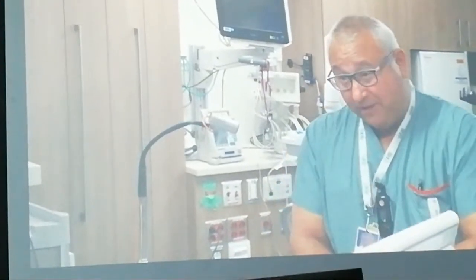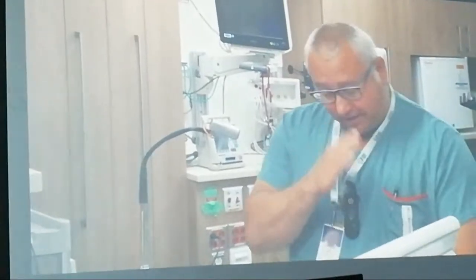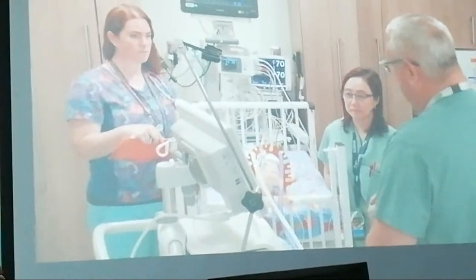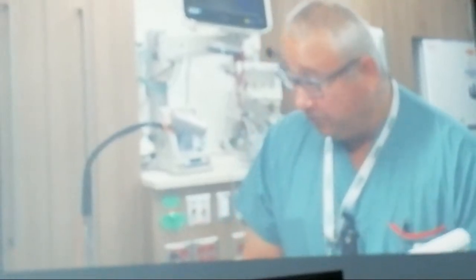Okay, everybody, we'll start the PEEP study. Are you ready? So what I'm going to be doing is adjusting the PEEP by 1, and then every 10 minutes I will be taking vital signs to make sure that we don't overdo it. To start, I've checked the compliance, and it's quite low. It's only at 0.2. So by no means is it good.